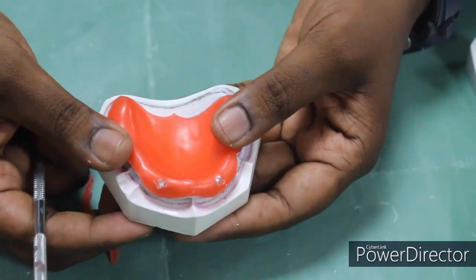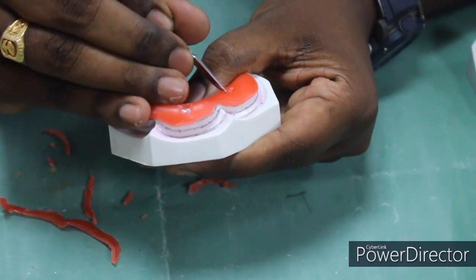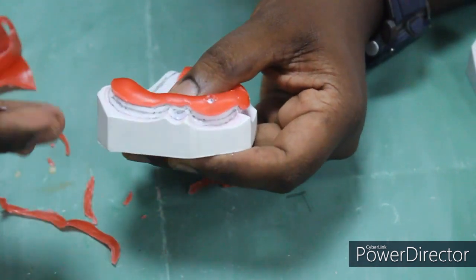One in the canine region, and one in the molar region on both sides, the first molar region.